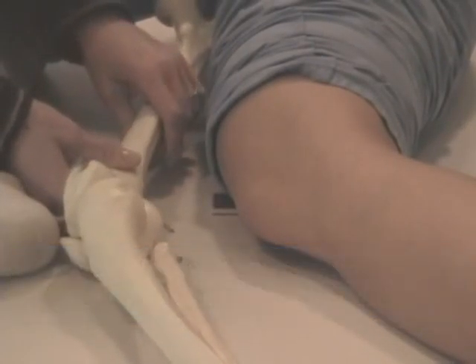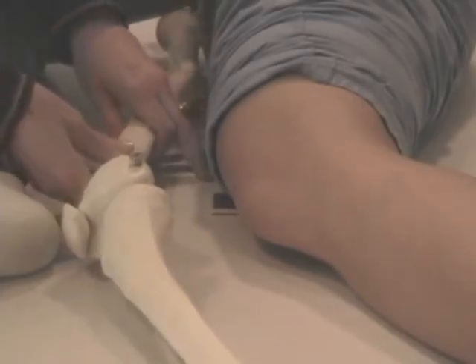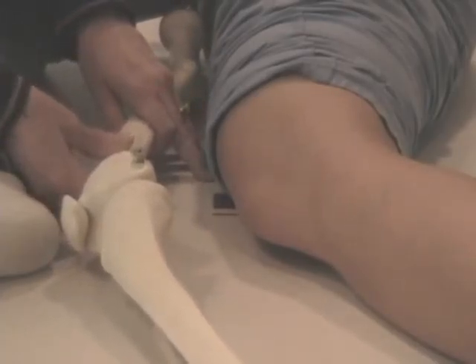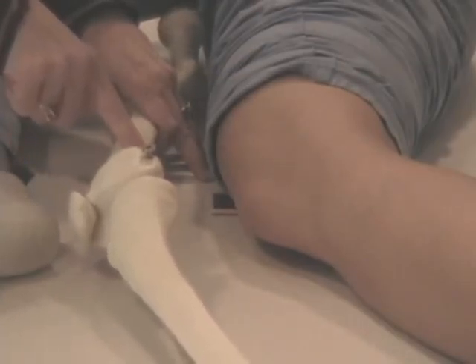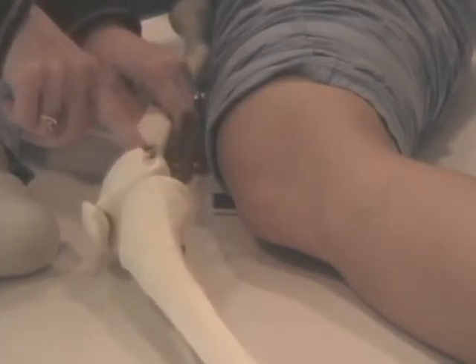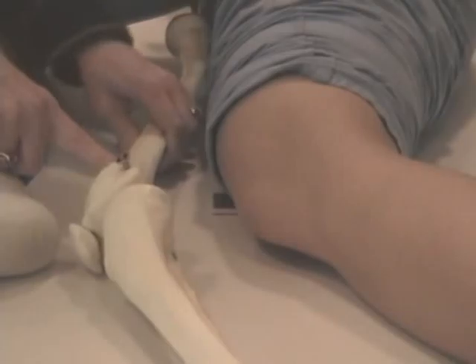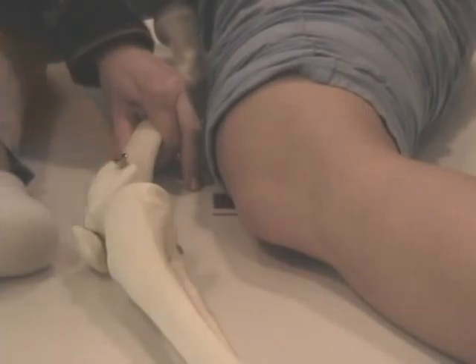Okay? The other thing that I want you to remember is the adductor tubercle. It's on the medial condyle. It's a bump right here. And when we look at an X-ray image, if the leg is too lateral, the adductor tubercle, which will help you identify the medial condyle, will be in an anterior relationship to the femur.